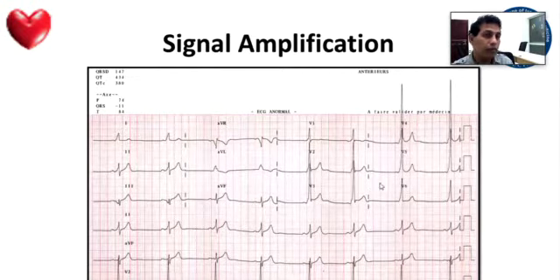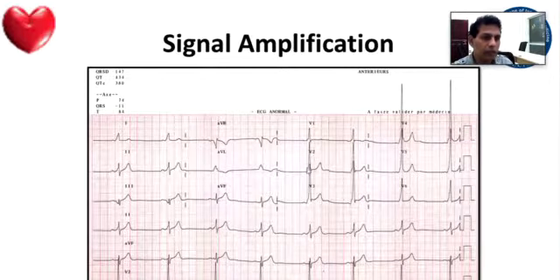Sometimes even smart ECG technicians, people who know a lot, can purposefully reduce the voltage and take the same ECG to get these into the ECG paper. This commonly happens when they take these ECG strips, because otherwise the QRS complex goes out of the paper. So you also should be smart enough to spot that. That is why we should pay attention to the paper speed and the voltage.